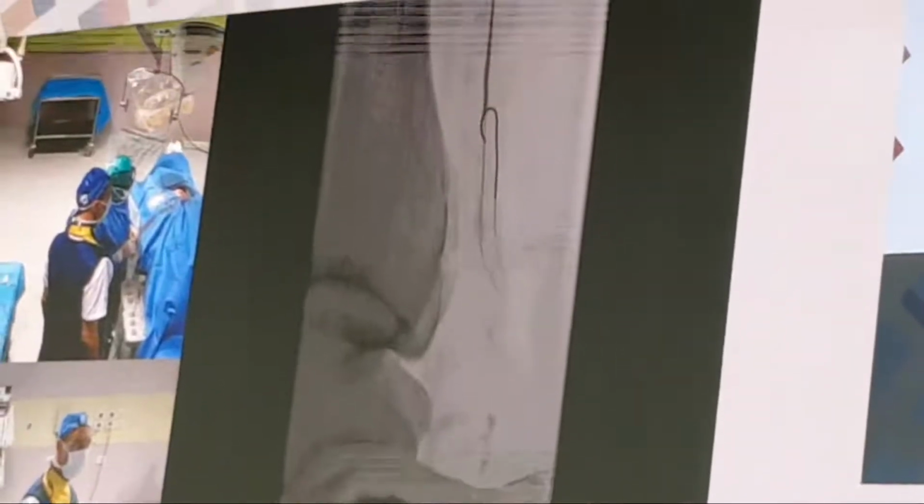In this case, I decided to shift from intraluminal progression of the wire to subintimal progression. You can see we are using the stiffer part of the wire immediately behind the radiopaque tip. The wire is manipulated with rotation. When we have the loop, in order to keep the loop as small as possible, we drill the wire with the loop.